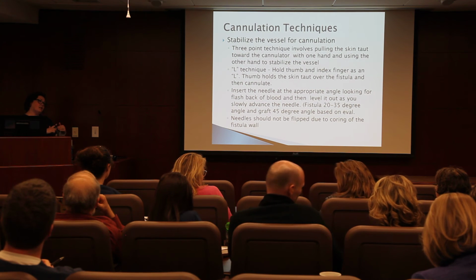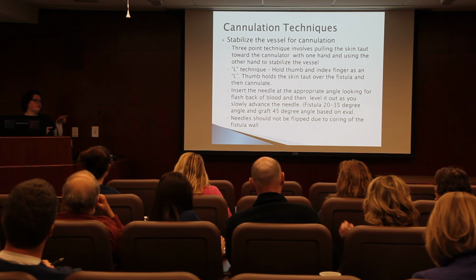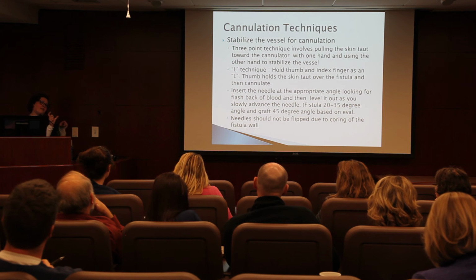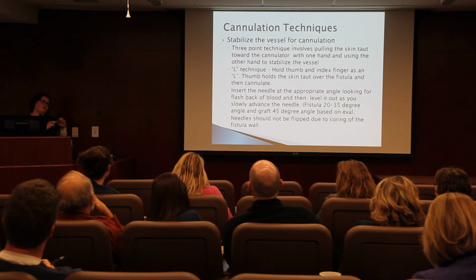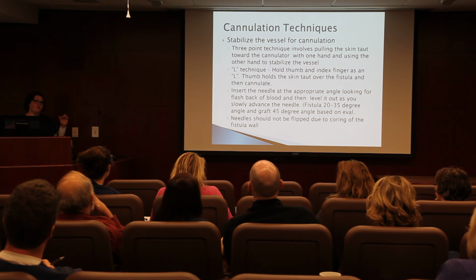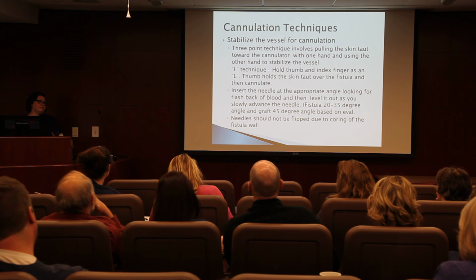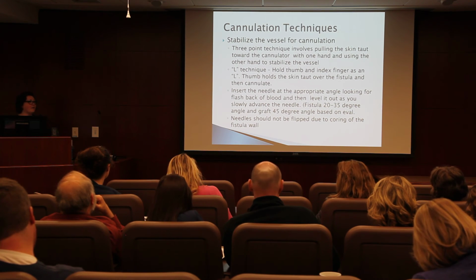So you put your first needle in, everything goes great. Then you go in to put what we call the venous needle, the top needle, and that infiltrates. There's only that much space between your needles, and you're like, oh, I can go here. You don't want to go below an infiltrate, you always want to go above it. If it's a severe enough infiltrate, I would just remove the needles and let that rest. Depends on how bad it is. Sometimes we'll say rest a week, at least a day. Sometimes we'll just let them go and come back the next day.